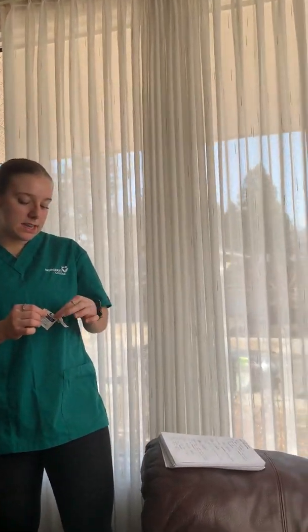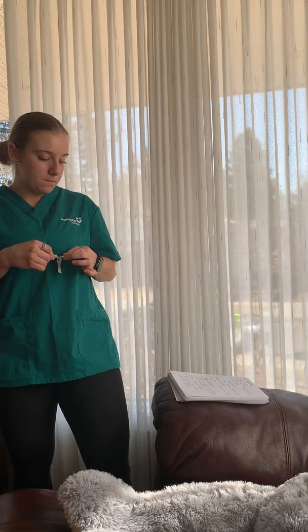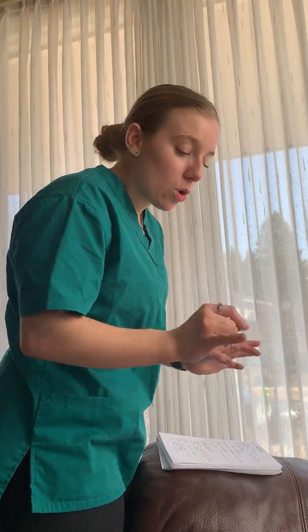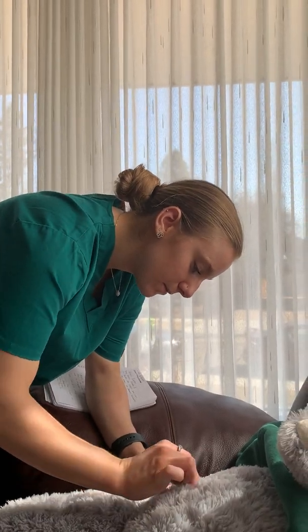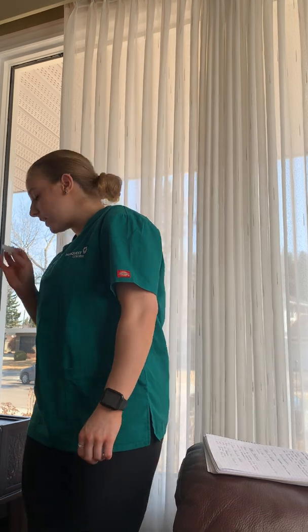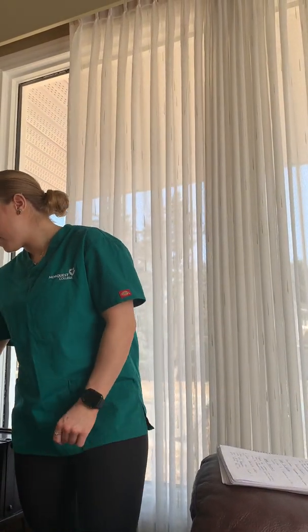So I will then take my alcohol swab and clean the site. So for right assessment, we want to make sure that there's no lesions, no edema, no bruising, nothing that will alter this medication today. Then once there's no alterations, no abnormalities, I will then clean the site. Let that dry. Throw the alcohol swab in the garbage.